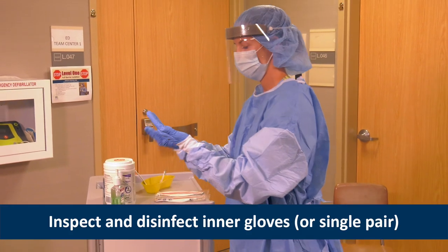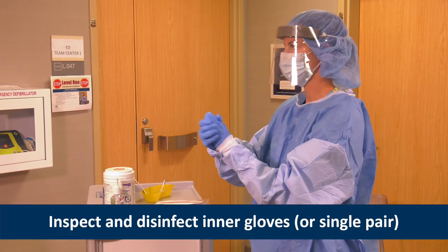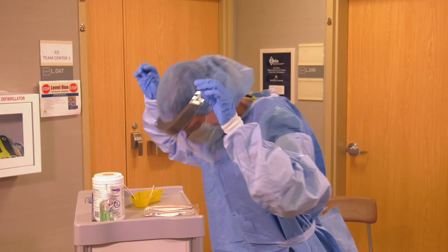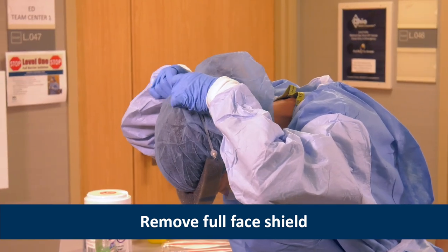Next, Heather inspects and disinfects her inner gloves. If a single pair of gloves was worn for a patient suspected of having a respiratory illness, inspect and disinfect. Heather removes the full face shield, leaving the surgical mask or N95 respirator on.